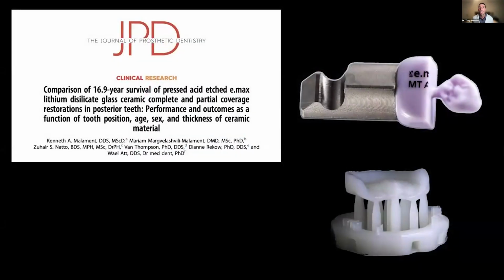I think of looking at the literature. I'm in academics, so I have to look at the data and what the data shows us about the clinical survivability of these materials. And when we look at studies that show a 17-year survival rate of lithium disilicate at 95+%, in my mind, that is a permanent restoration.